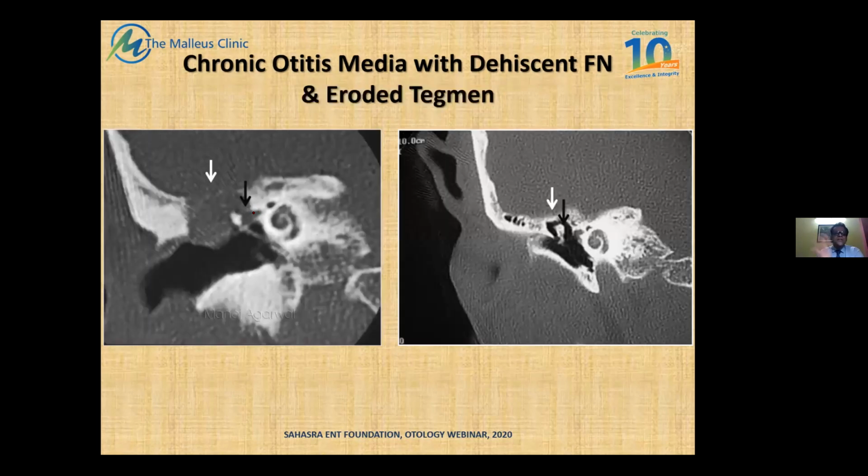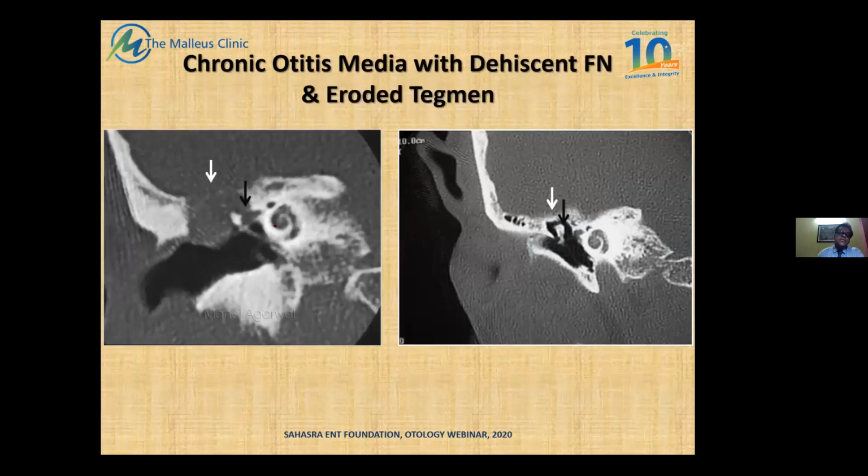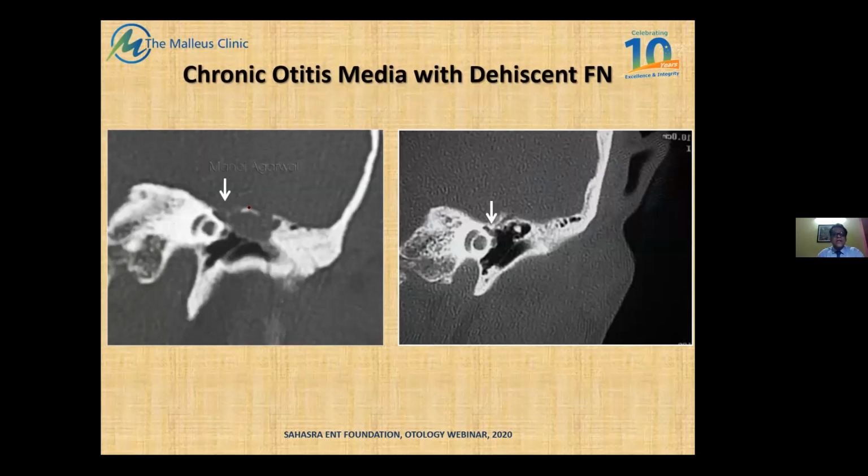In the previous one, in this particular slice, what we had were the two segments of the facial nerve separately. We've moved a little more anteriorly. Mind you, it's a different patient because the side has changed. This was the right side, but we have come to the left side, and a little more anterior. This is not the facial nerve, dear friends.